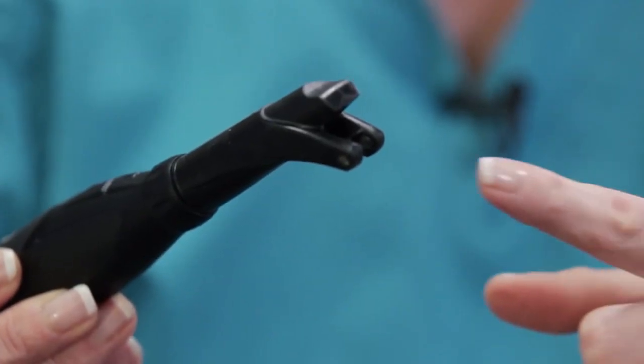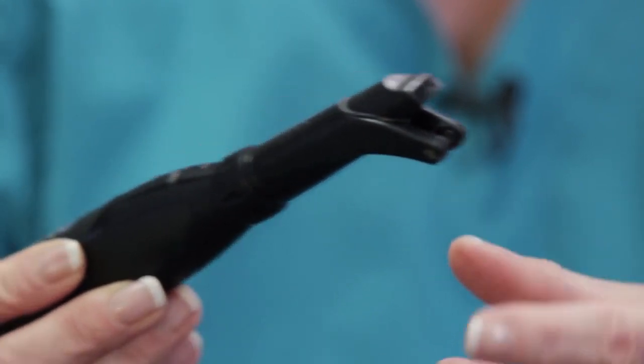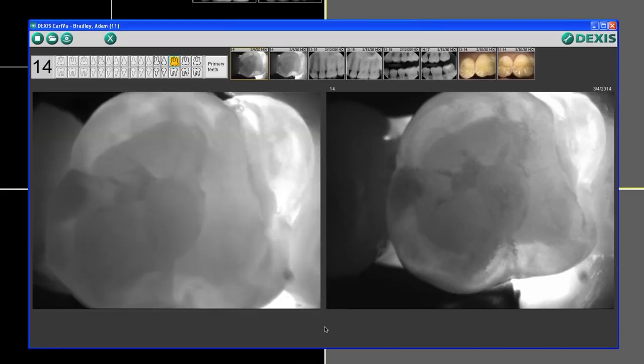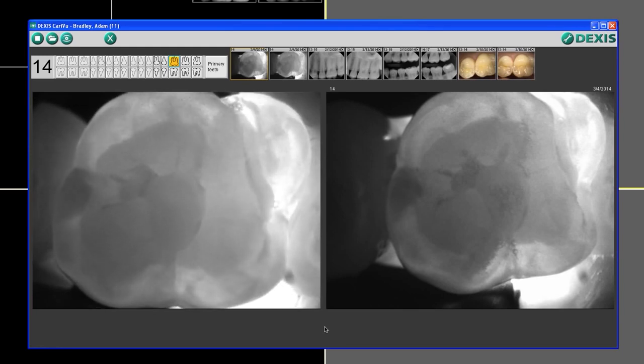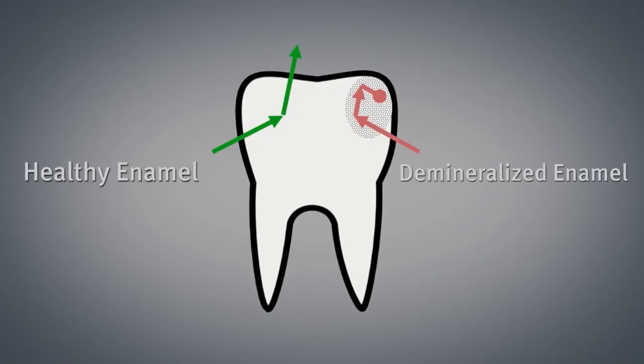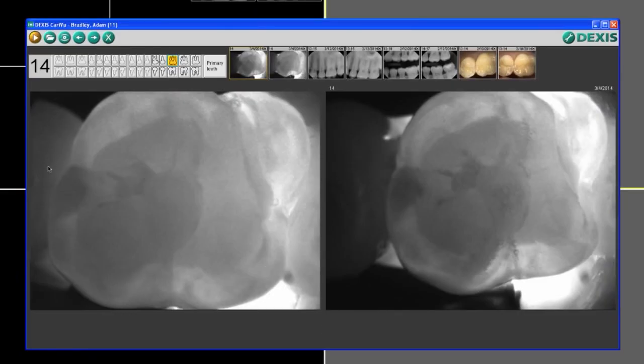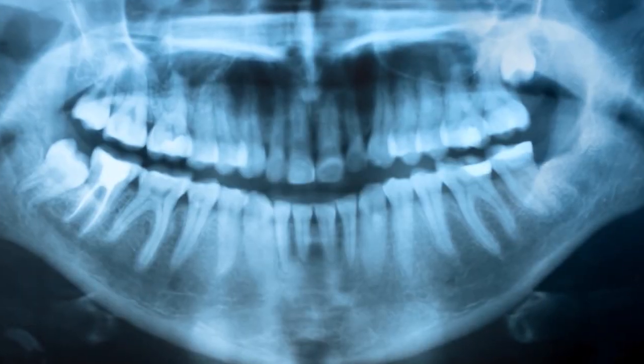Translumination is a non-X-ray near-infrared light, and what the device does is it shines through healthy tissue. That means if there's caries or decay, the tooth is porous and so it's detected as a dark surface on the image itself, so that you can see the difference between light and dark just like you would in an X-ray.